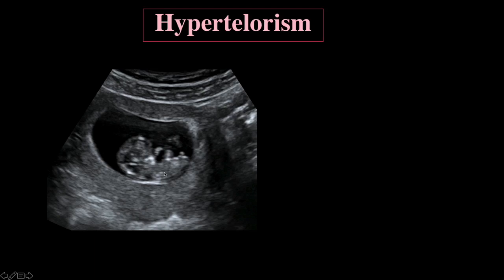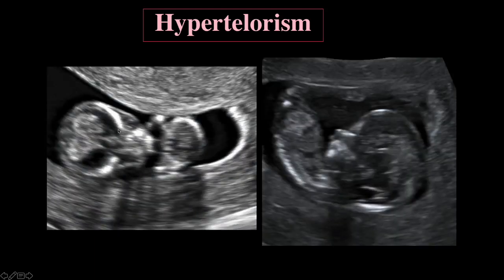The body is tiny, and let's look at this big head, little body here. This is asymmetric IUGR on steroids, basically, in the first trimester, which is very obvious. I've made the mistake of under-measuring these and trying to reset the gestational age. I've only done that once. I'm not going to do it again because I didn't spot the fact that the head was too big. So always keep that in mind because it'll come back abnormal, obviously, eventually.